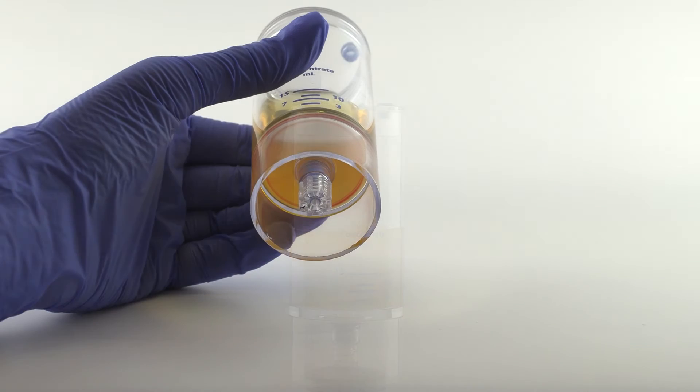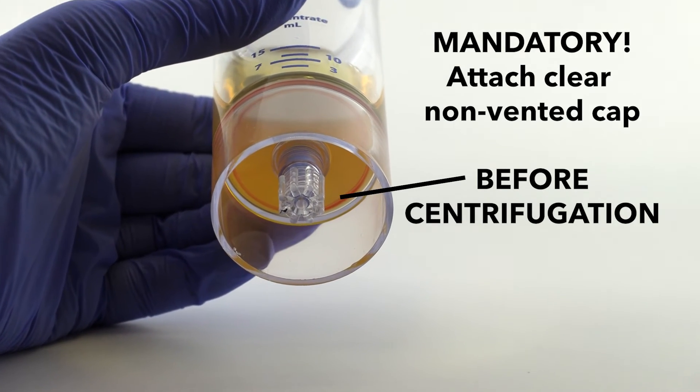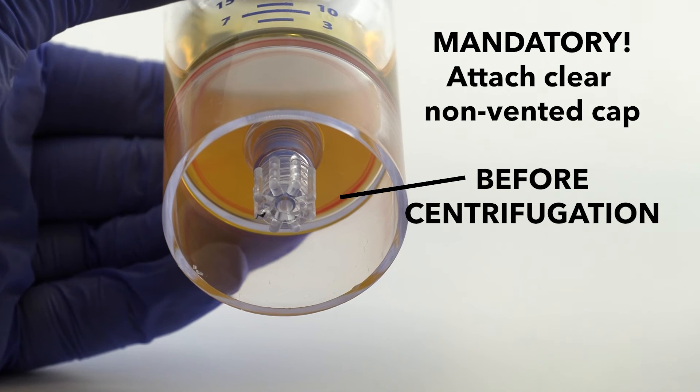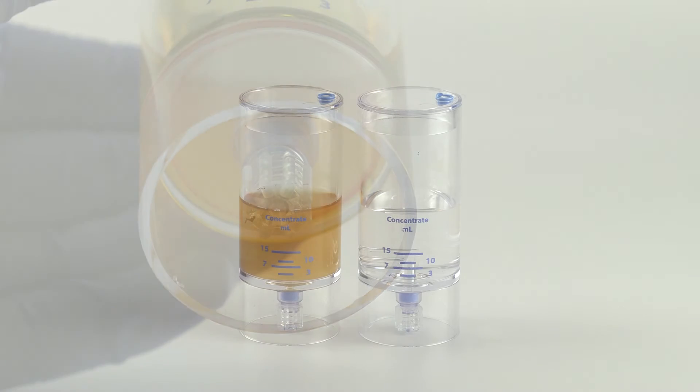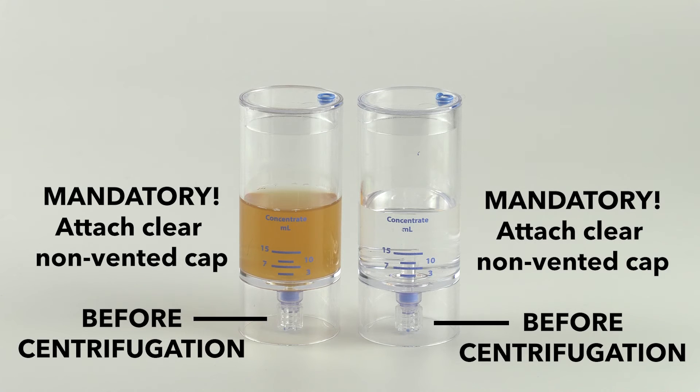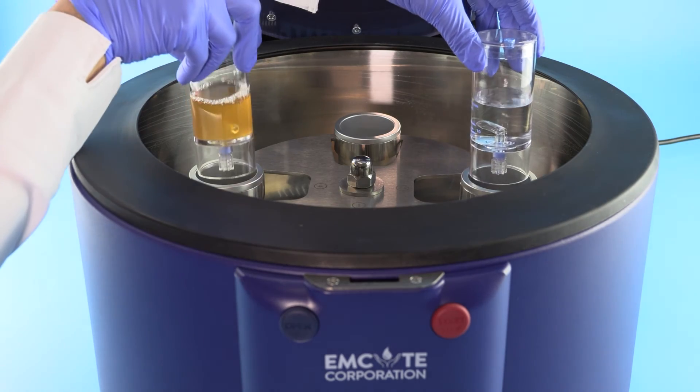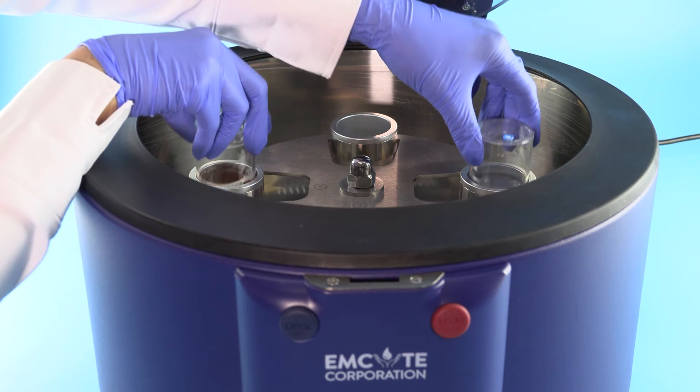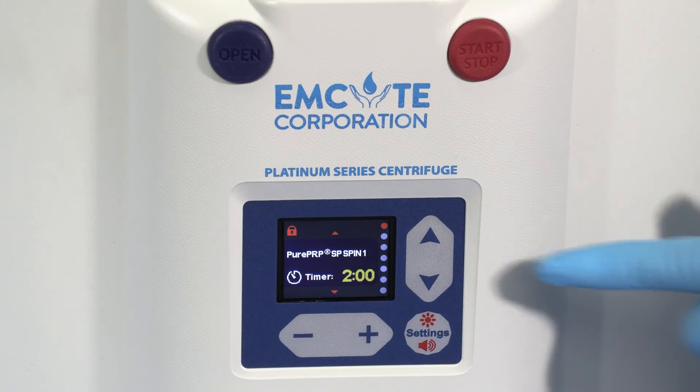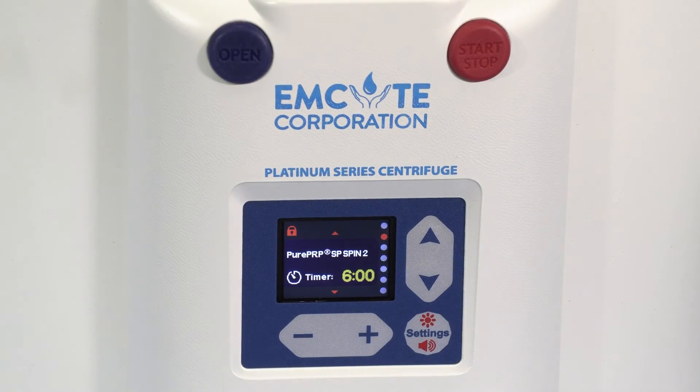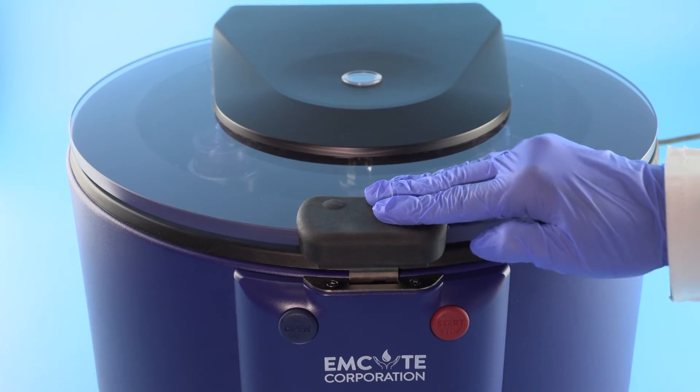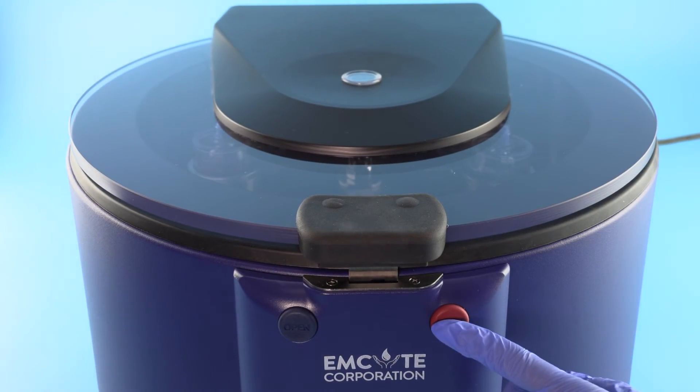As a mandatory step, always attach the clear non-vented cap to the bottom port prior to centrifugation. Counterbalance with equal volume. Be sure to always place the clear non-vented cap to the bottom port of the counterbalance device as well. Place back into the centrifuge rotor at opposite ends. Follow the protocol settings provided in the Pure2 IFU insert. Close the centrifuge lid and press start.